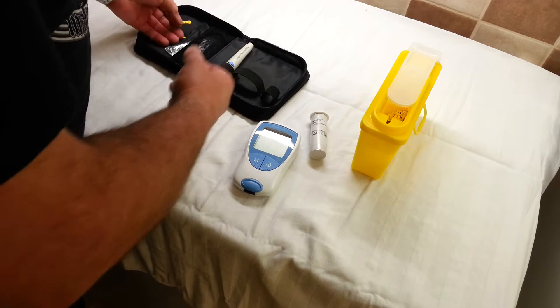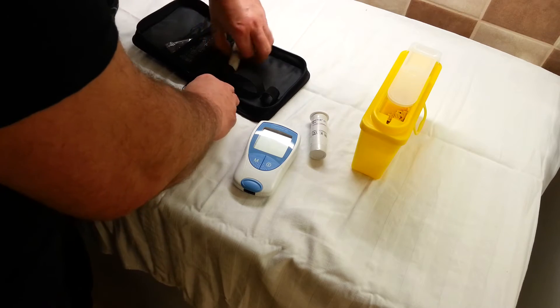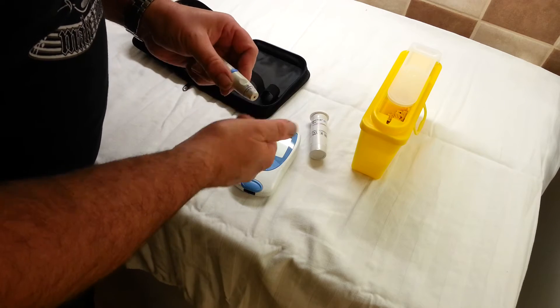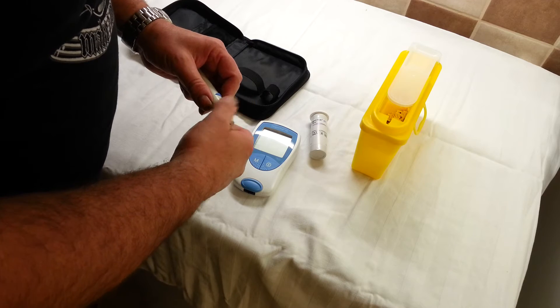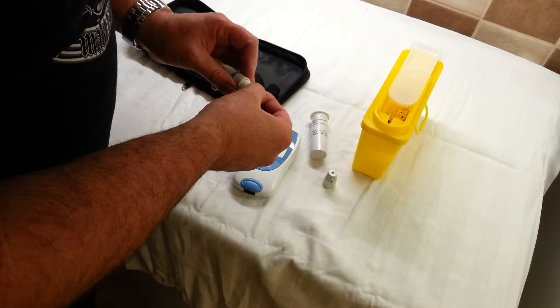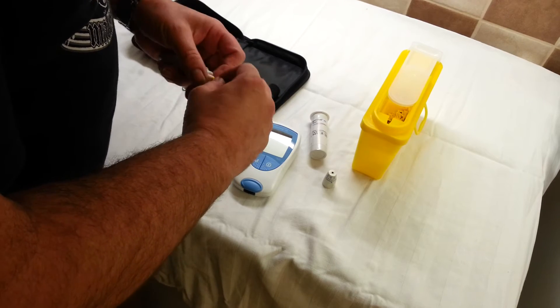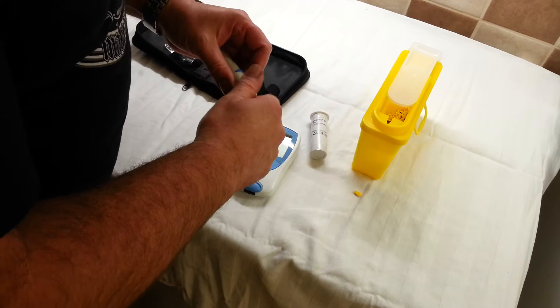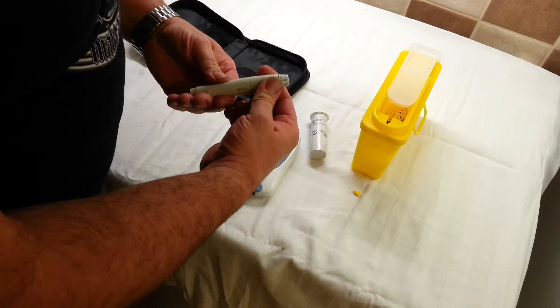Before you start — and I've already done it — always wash your hands in warm water. Apart from anything else, it helps if your hands are warm when you do the test. The sharps are a single-use disposable; particularly this type of pricker is only for single patient use.